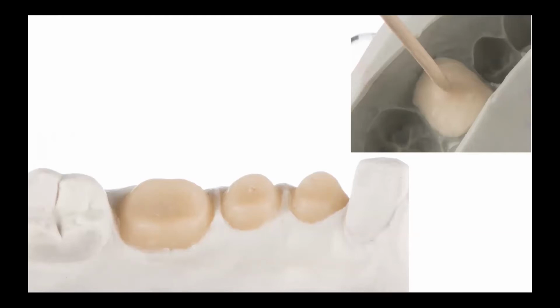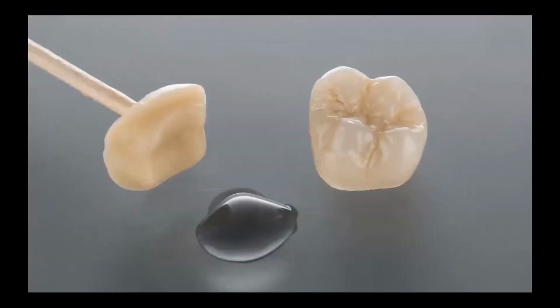And in this case, I used white wax to fix the wax die, but I can use pink wax as well, and this would be an even better picture, because this way I can take into account the influence of the soft gum tissues of the patient that influence the final shade of the restoration.